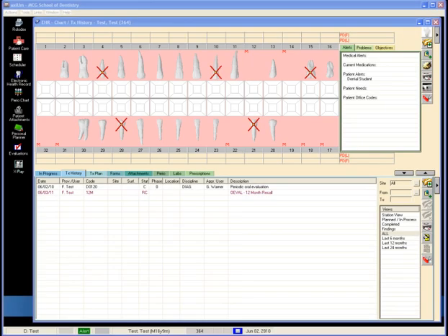Good morning, afternoon. This is intended for the returning sophomore class. This is your summer exercise in Perio 5001, intended for you to complete your summer clinical exercise on one another. This is not a complete periodontal evaluation examination charting. However, we're going to focus on four things today.